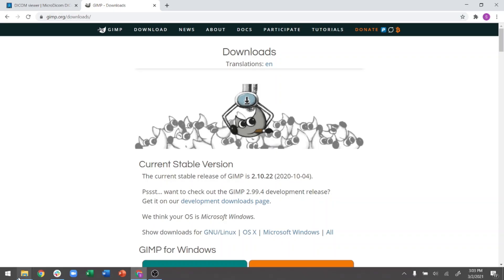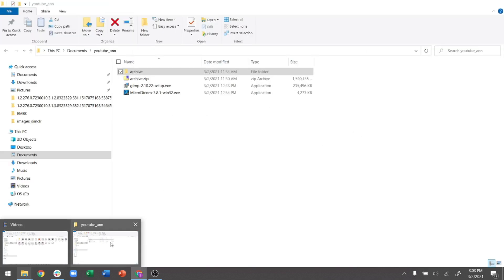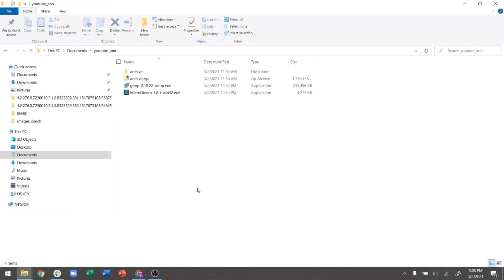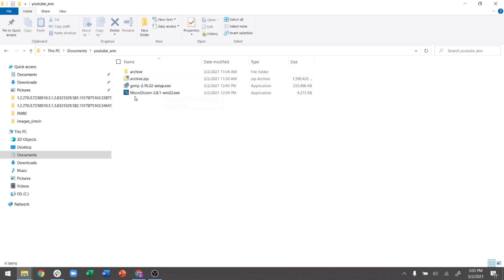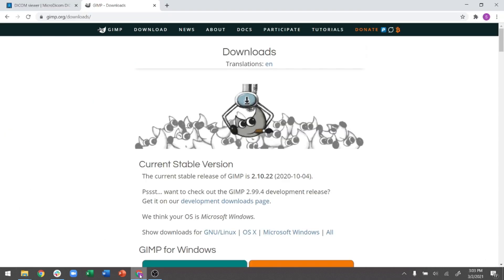Today we'll be learning how to annotate medical images. For this tutorial I have three things downloaded. The first is called Micro DICOM. Micro DICOM is very powerful for visualizing DICOM images, which is generally the format for medical images.